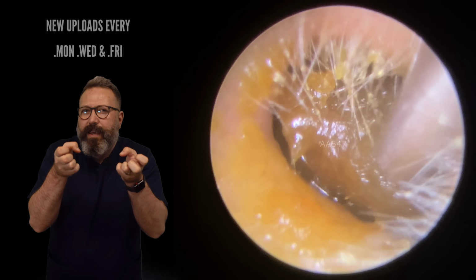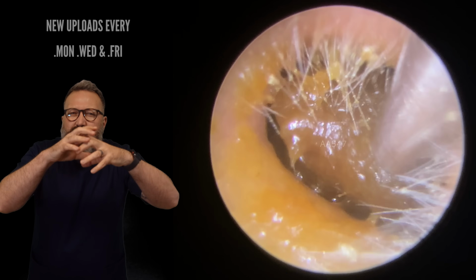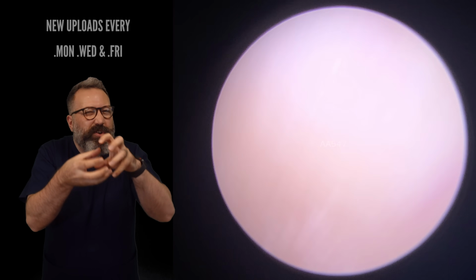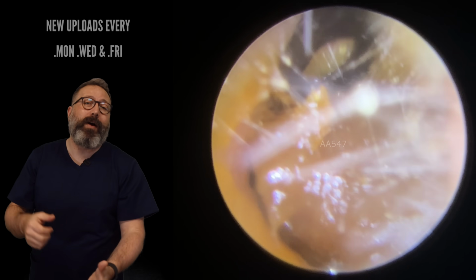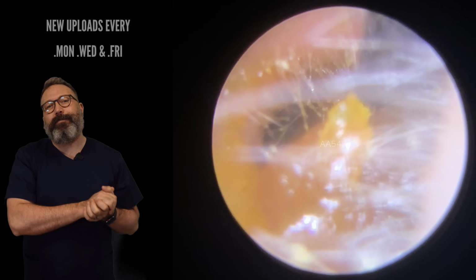So I think what we've got here is this outer dry sort of surface layer of wax, which is a little bit tougher, and then this soft squishy wax in the middle. Now, if you've watched this channel for a couple of years, you know I've referred to this as armadillo wax before, because they're crunchy on the outside and they're soft in the middle. And that's exactly what we're going to get here as well.